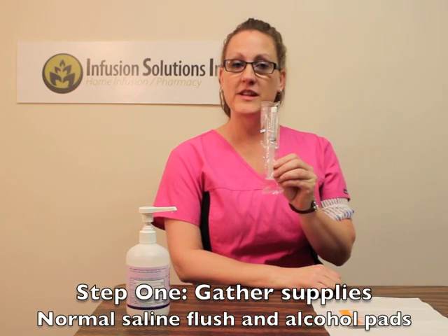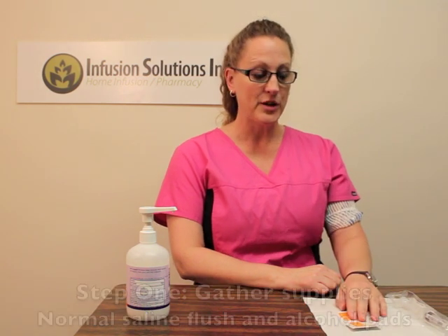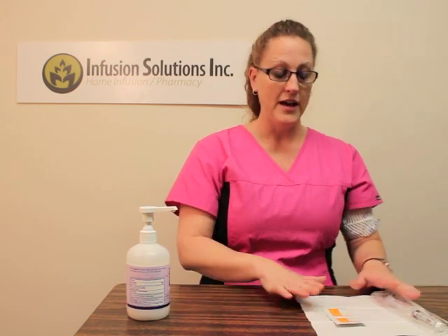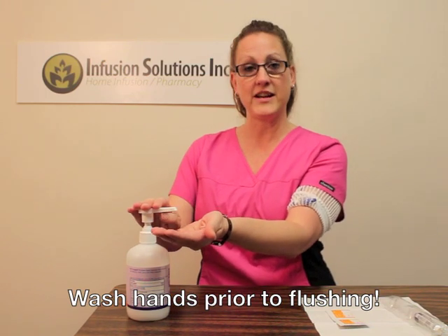The first thing you're going to need is your supplies, which would be normal saline flush and some alcohol pads. You're going to make sure that your surface you're working with is clean, whether you clean the surface or you use a barrier. Get your supplies ready, and then wash your hands with soap and water or hand sanitizer.